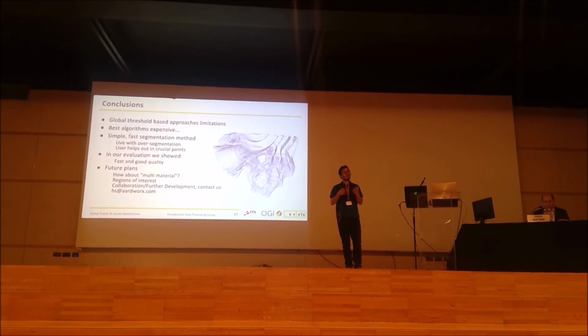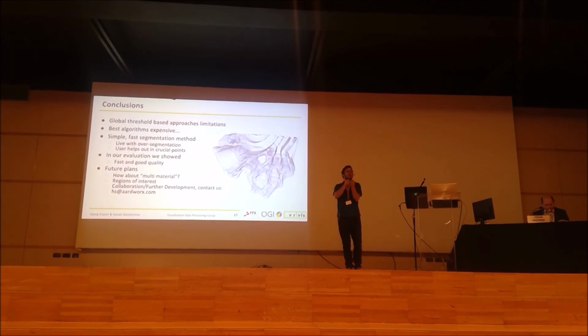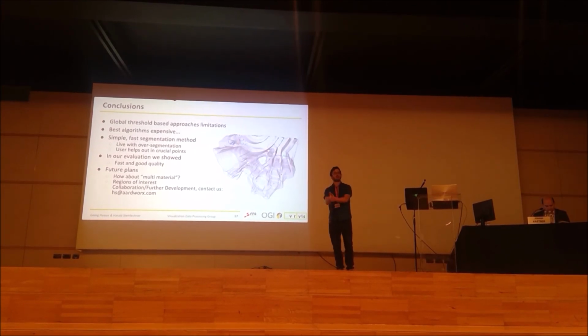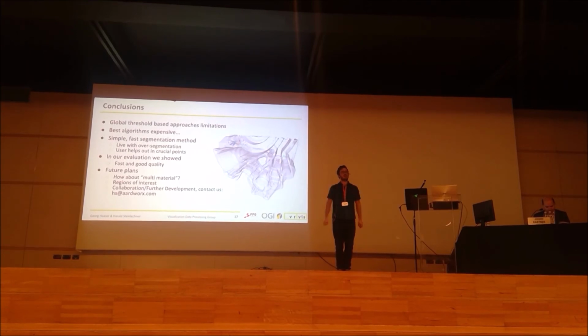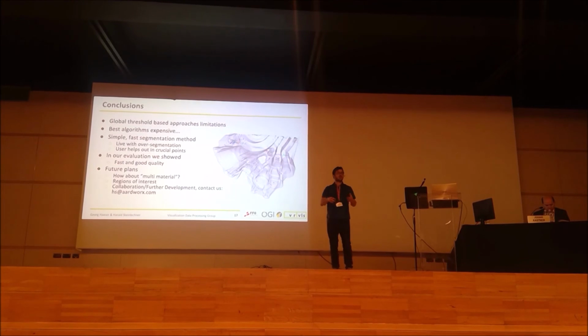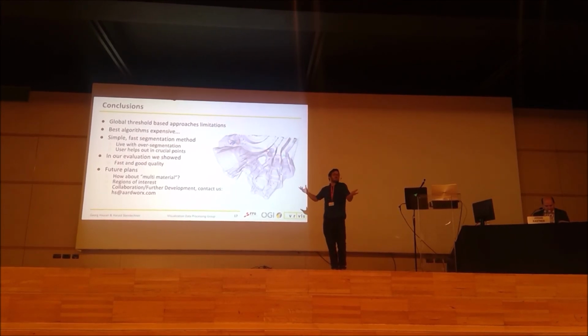The interesting thing here is that you don't have a fully automatic, hard to work with algorithm with very many parameters. You take the simple algorithm and you get okay results because you have user insight and expert knowledge you can plug into the algorithm. A fully automatic algorithm is nice, but here we just go a different way.